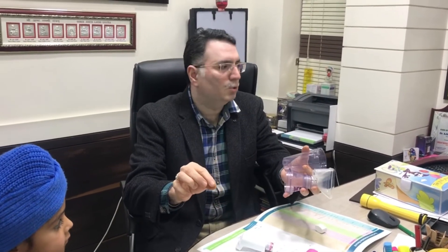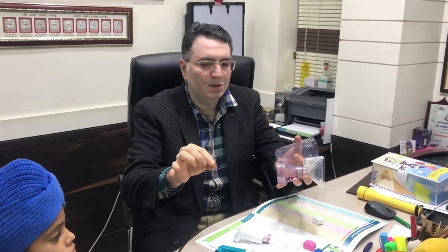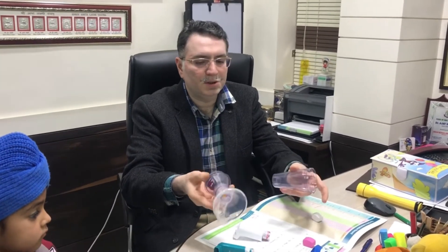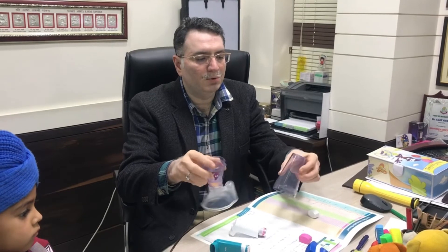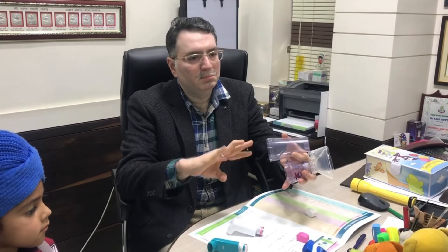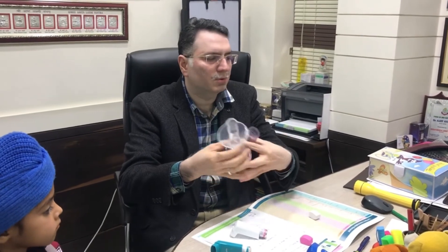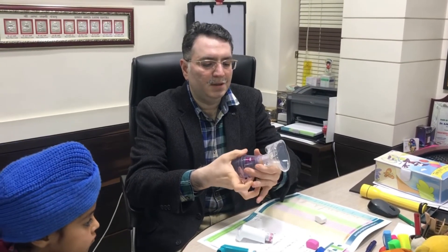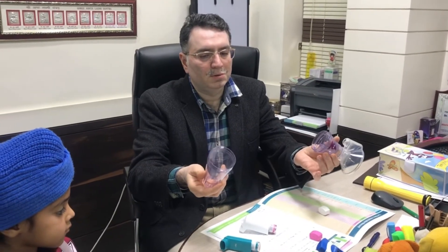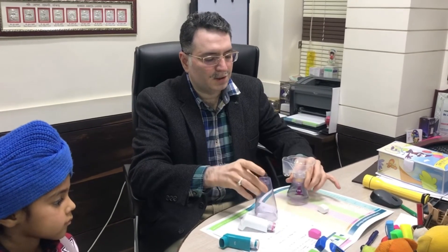When I put a little water in — the water should be very warm. Then I put a little soap or detergent. Then I put a little bit of water in and mix it. I add soap like this.